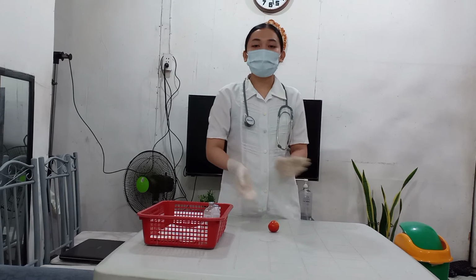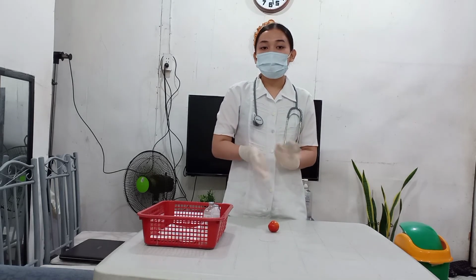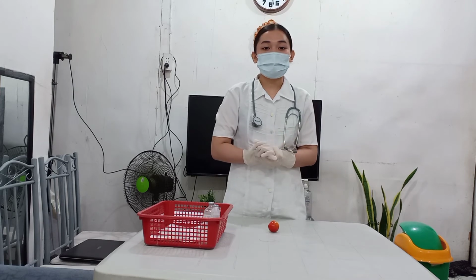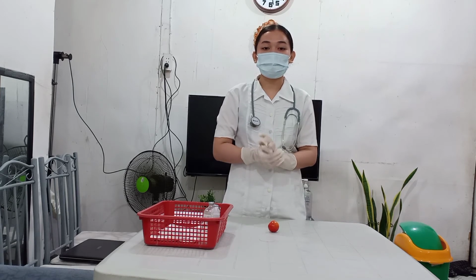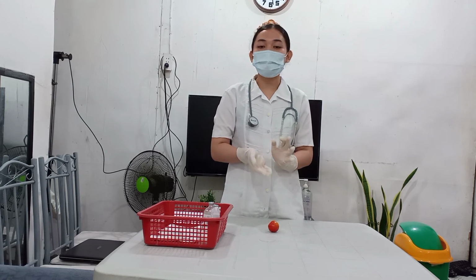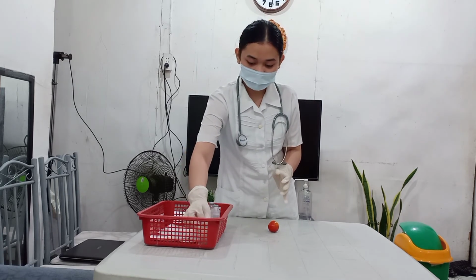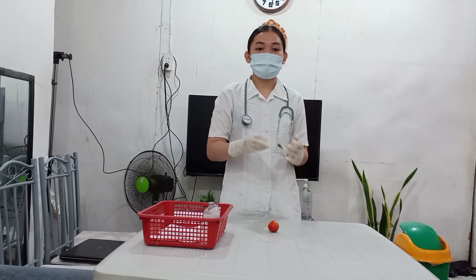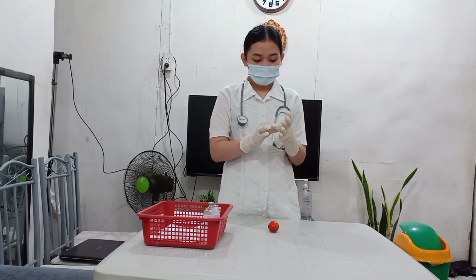Okay, so while waiting for the antiseptic swab to dry, we will now place and hold the swab between the third and fourth fingers of the non-dominant hand. This allows for easy access to dry gauze after injection. We place it between the third and fourth. Here.